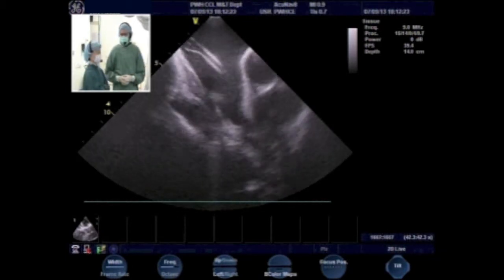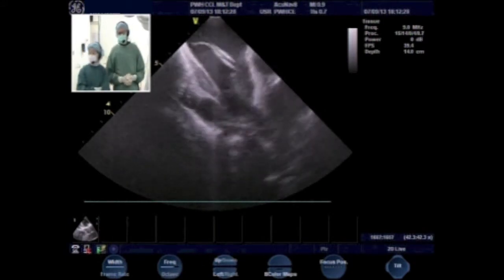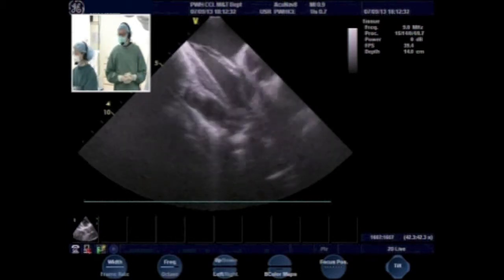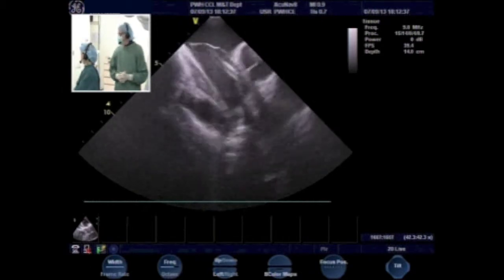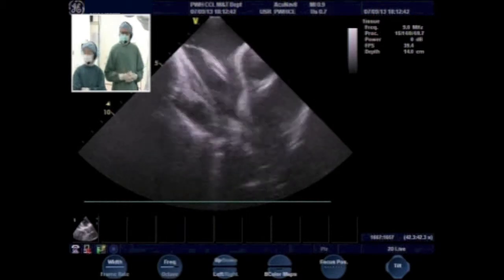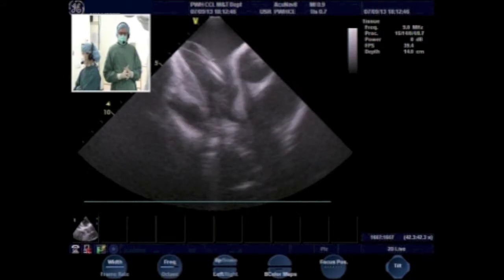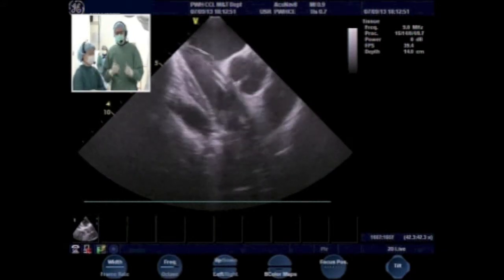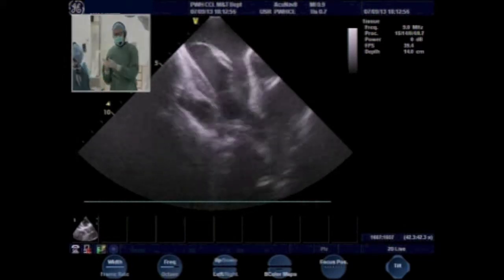If you're going to use an Occlutech, it comes in steps of 3 millimeters in this range. So it's 24, 27, 30. I think a 27 first. Do we have a 30? 27. You want to swap? That's much easier because you have less choice. Yeah. So I would suggest that Anna and I load the device. You go to the room next door. I think they're quite keen to continue with the LAA case.